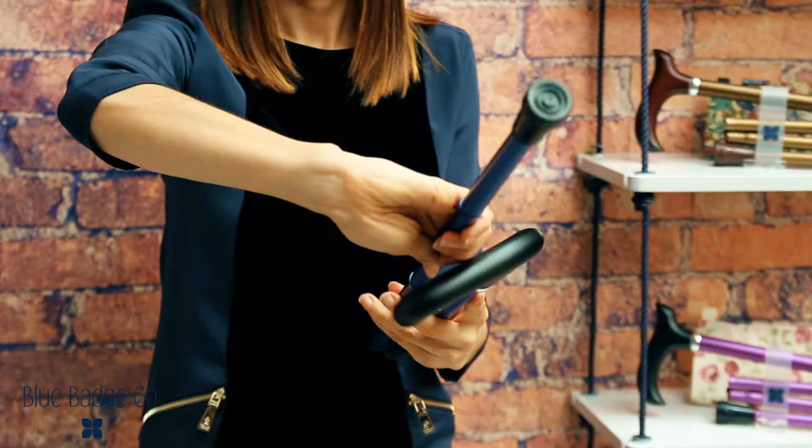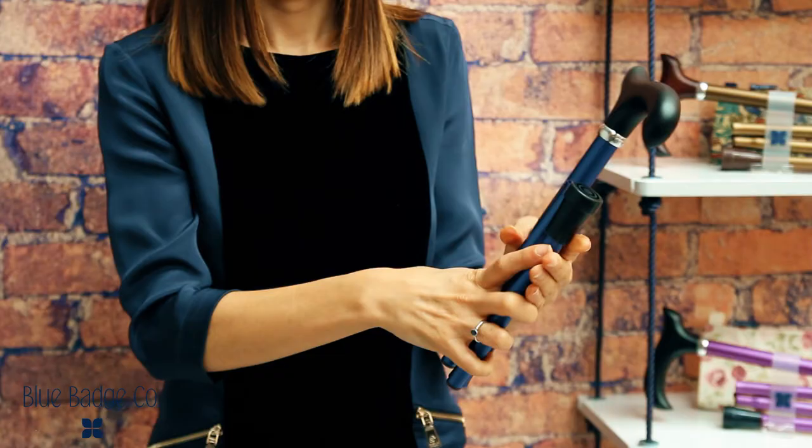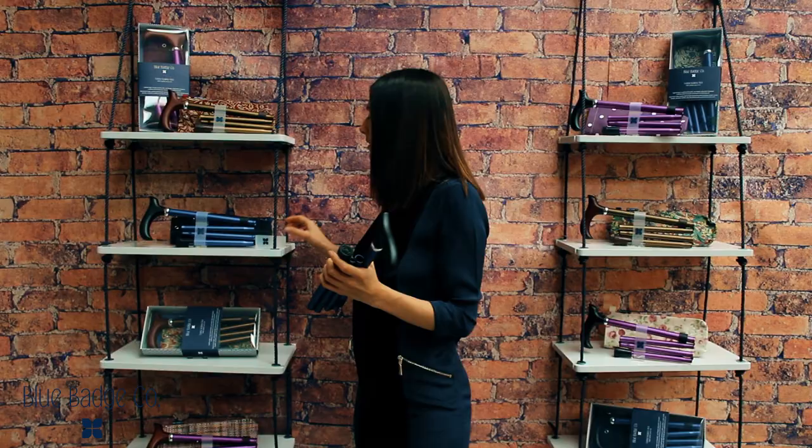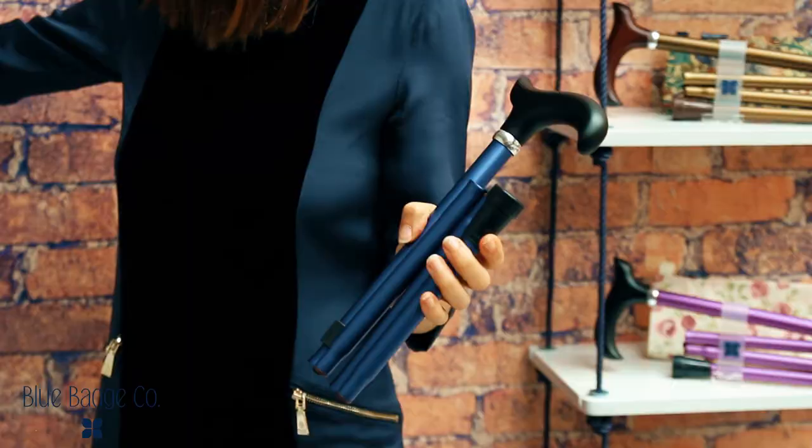Turn and fold. Turn, pull and fold. To hold the stick together in the folded position, you can either place back on the plastic brace or you could store the stick in one of our convenient carry cases.